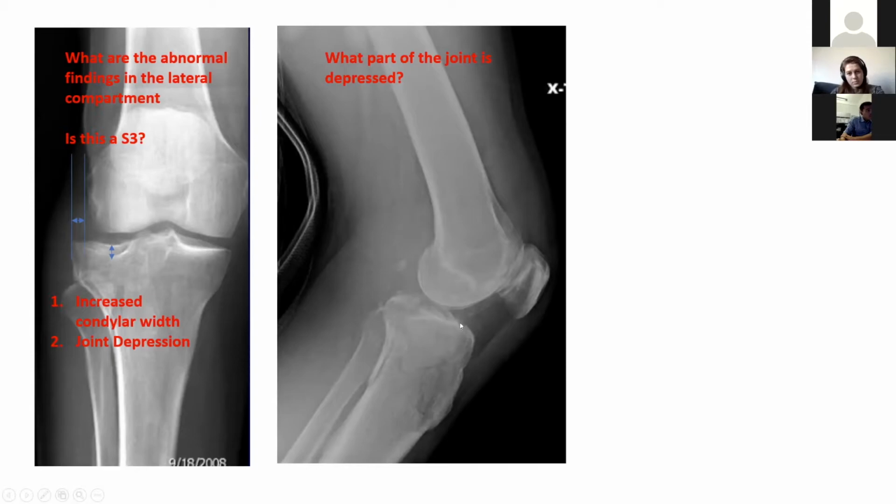Totally involved. So this is our concave surface. You see my mouse there? That's the front part of the joint. And then you see a bit of comminution there with a little line going posterior. I'd say that's the medial portion of impaction, but the more substantial area of it is also lateral. See that line there? That is your convex surface that posteriorly is pointing downward, along with this spike. So if I was a betting man, I'd say that this is a posterolateral split that has dropped down.